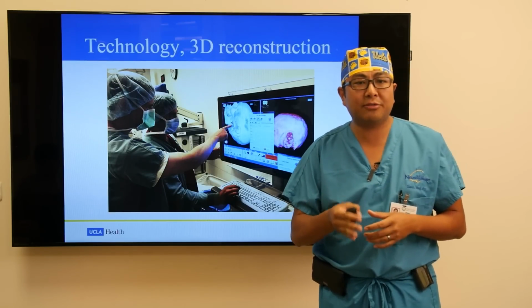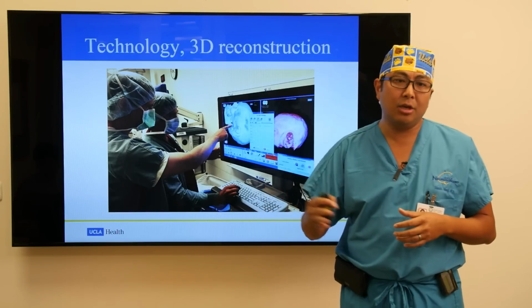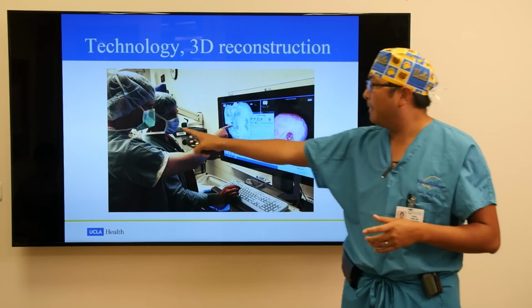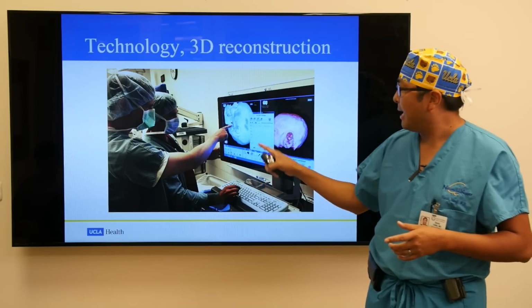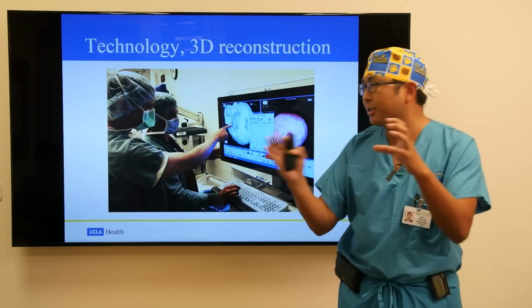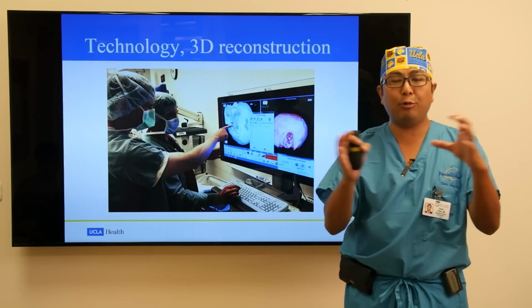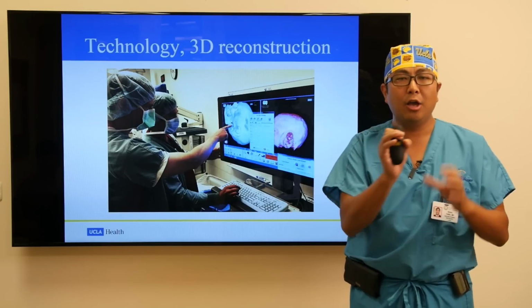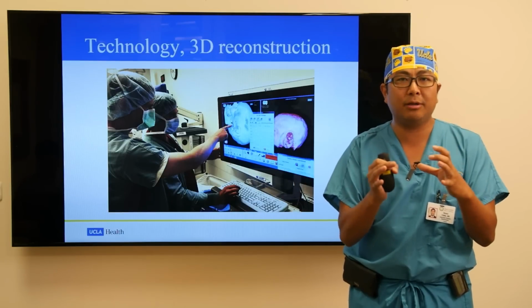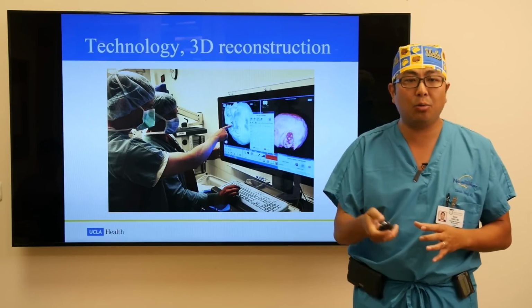And so for all of our cases, we use surgical theater to do 3D reconstructions. Here, this is my partner, Dr. Quentin Gopin, and he's looking here at the head. And what we get to do is change the size of the hole. Using a 3D reconstruction and a mouse pointer, you can change the size of the hole.